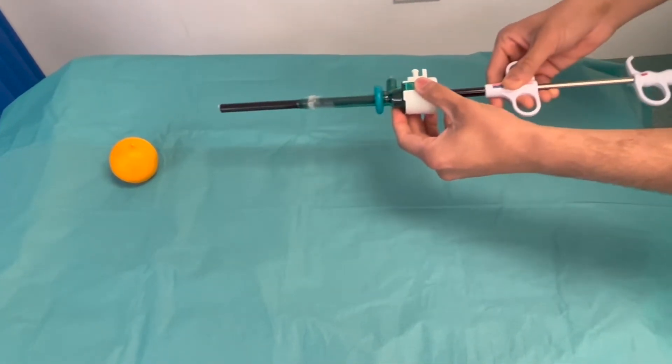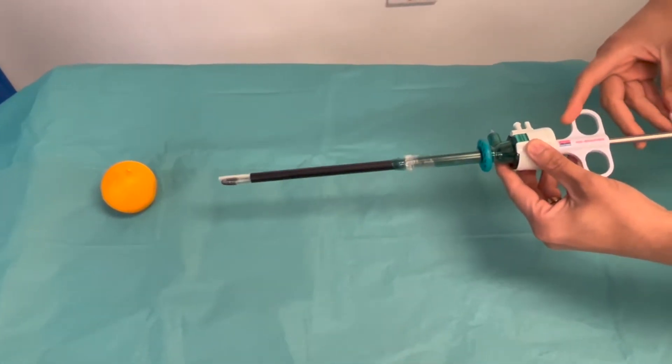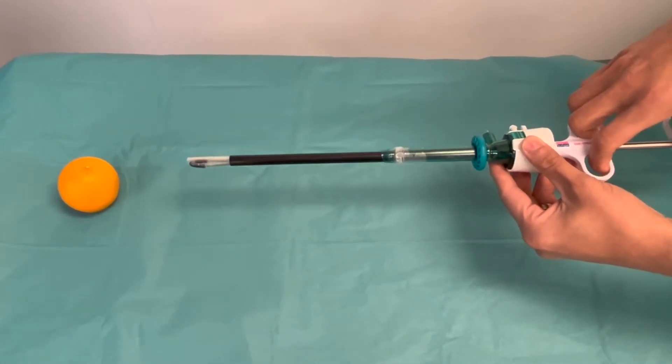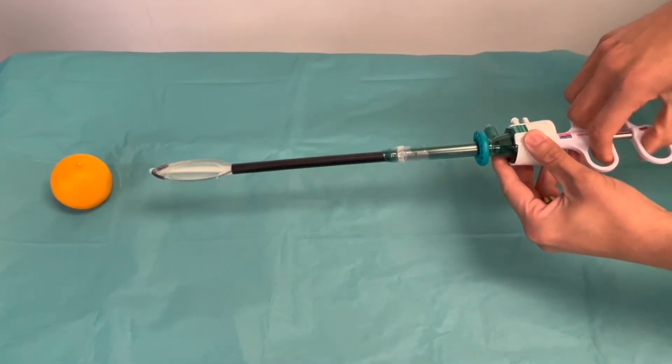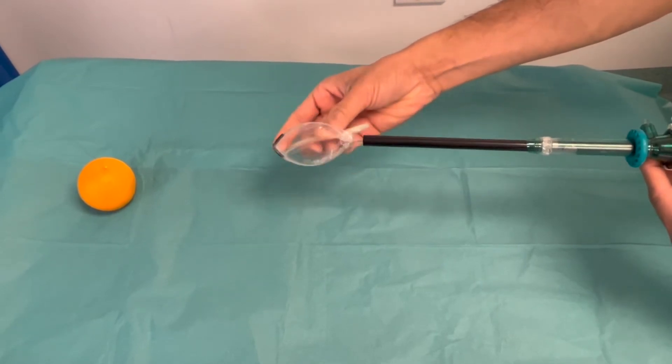After introducing the endobag, the trocar is pushed, making sure the markings are facing upwards. The bag with the mouth end then opens in the peritoneal cavity.